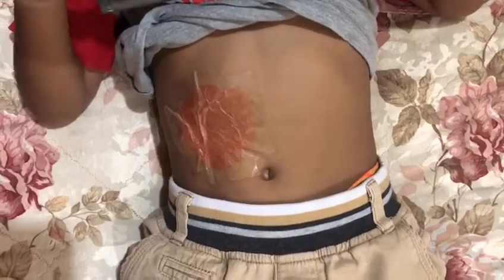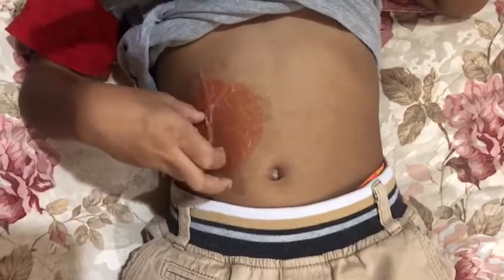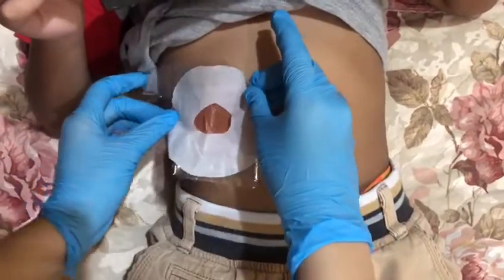If the patient accidentally touched the stoma site, make sure to clean the patient's hand. And after that, replace it with a new one.